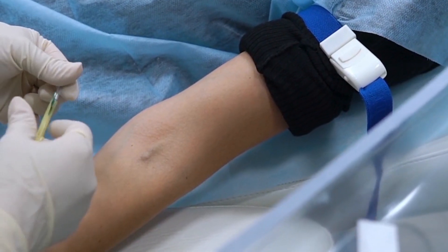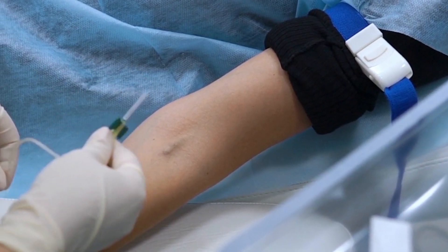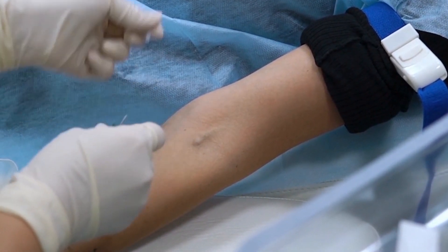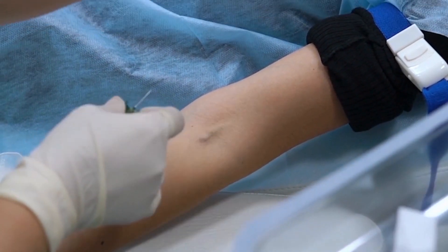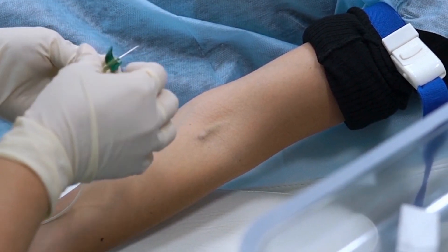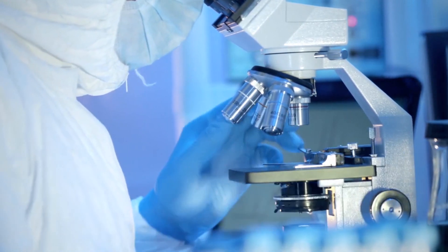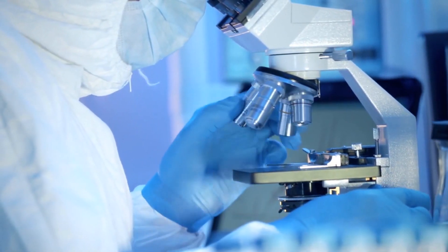Welcome to MediLab Zone. This video is about venipuncture procedure. Venipuncture is the procedure of inserting a needle into a vein, usually for the purpose of withdrawing blood for laboratory analysis.